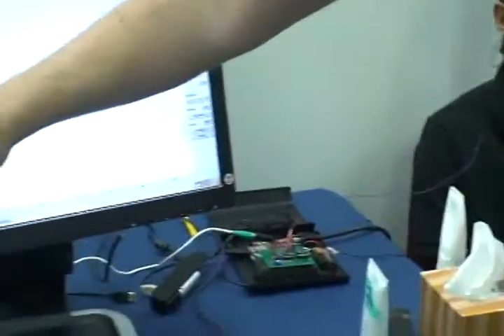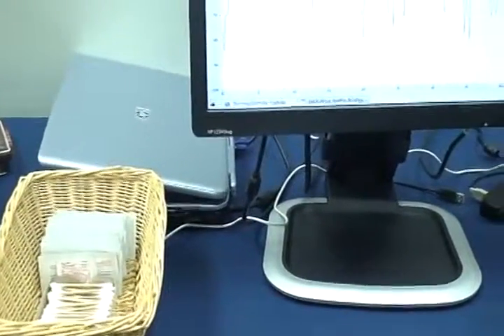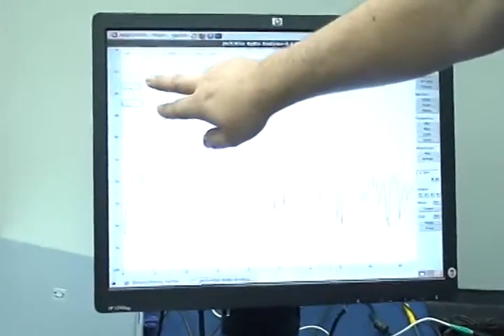So reading very generally from Arnold, this is the actual frequency right now. This is the FFT, and there are 2 bar graphs showing the relative strength of each state, the alpha and the beta. So depending on how relaxed or concentrated he is, they will vary over time.